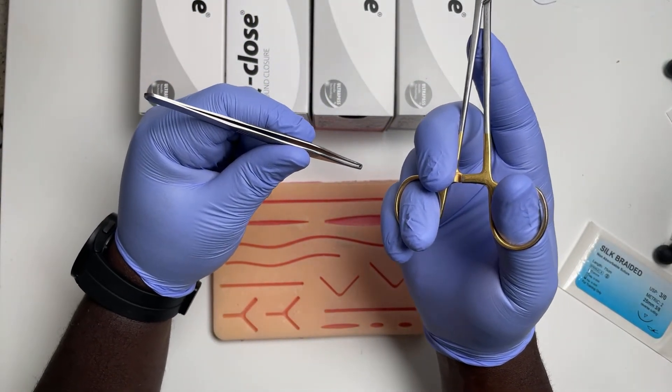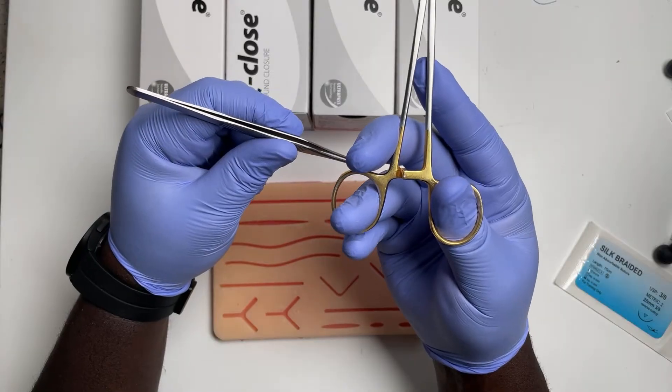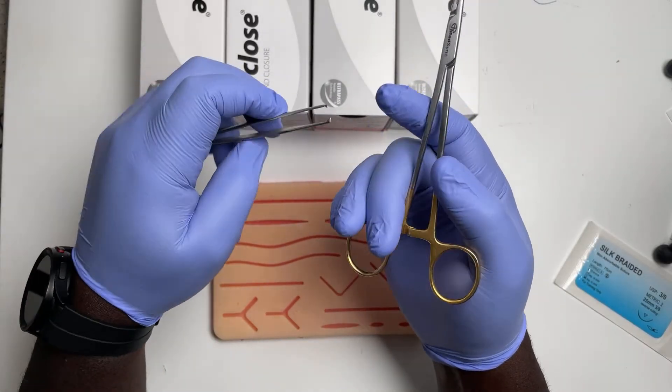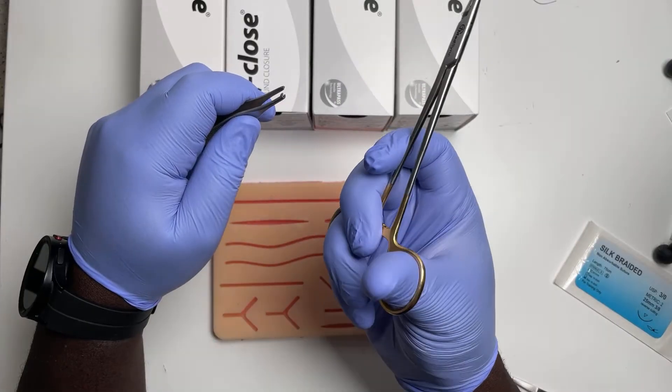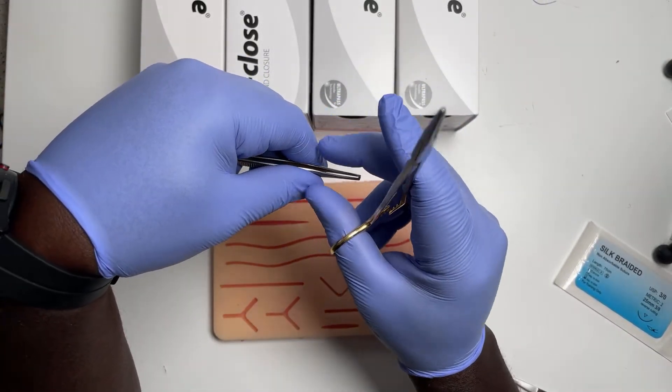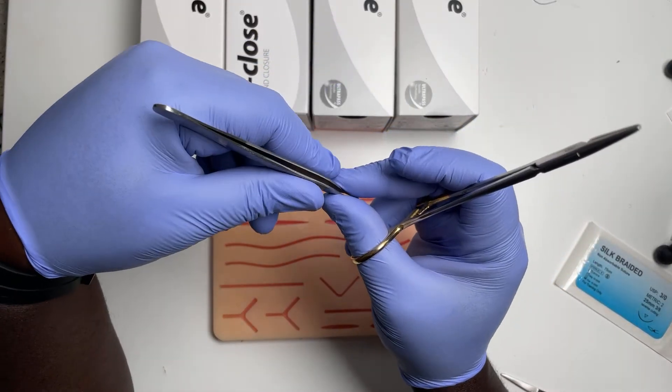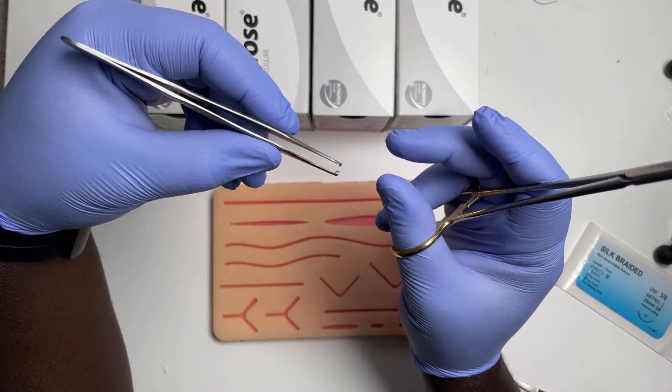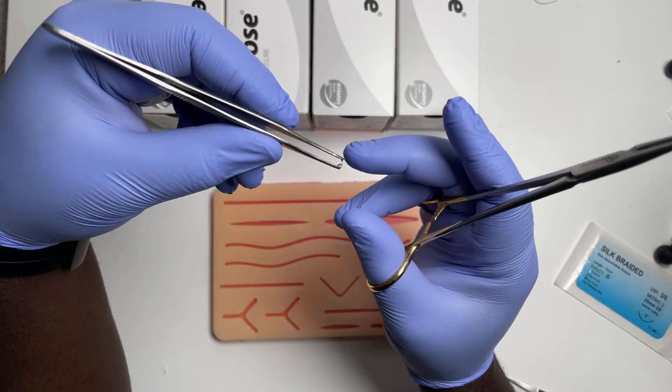Forceps are like this. One of the key things people do wrong when they're starting, when they're stressed, is they go into this position. So two things that are wrong here. The forceps should be on top of the finger. Your finger should be further down so you can apply gentle pressure between the teeth.